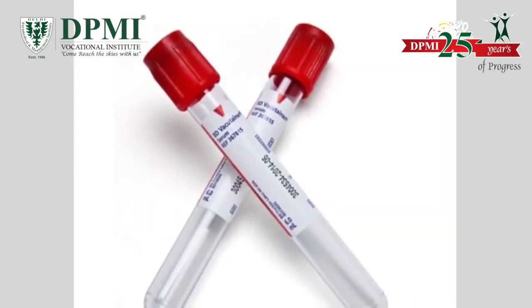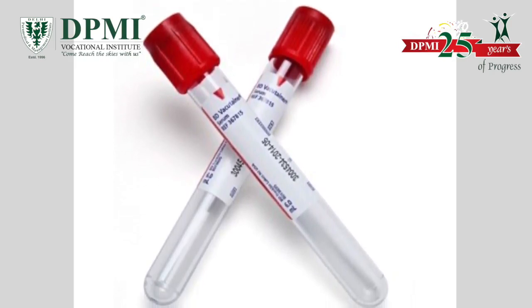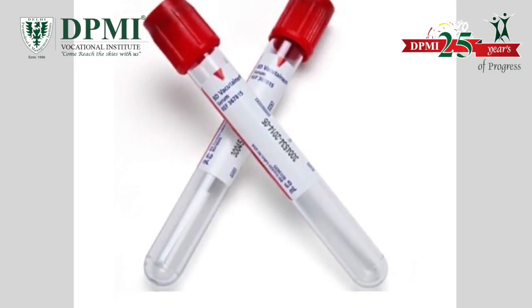Red top. These are additive-free VacuTainers used for testing serology, antibodies, chemistry and drug determinations, and also for blood banking.